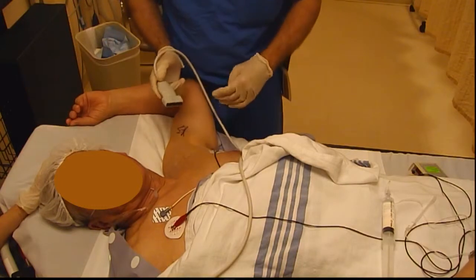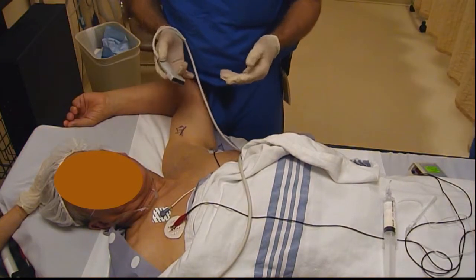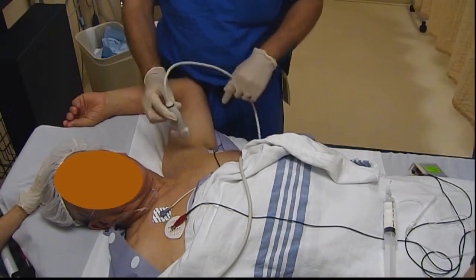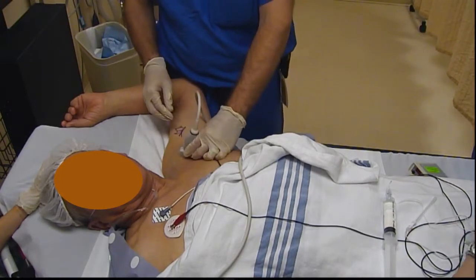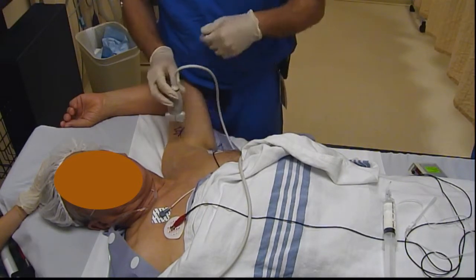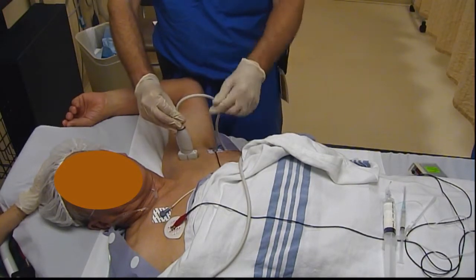The three elements of importance when it comes to doing an ultrasound-guided infraclavicular block have to do with your starting setup. Before the needle's even inserted, there are a couple of things you want to make sure to do. First is to find a place as lateral as you can, starting at around the deltopectoral groove, where you can see the target structures. If you look closely at the probe, perpendicularity to the skin would be right about here.